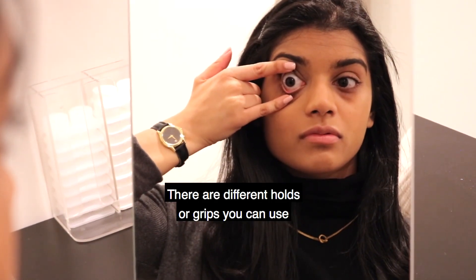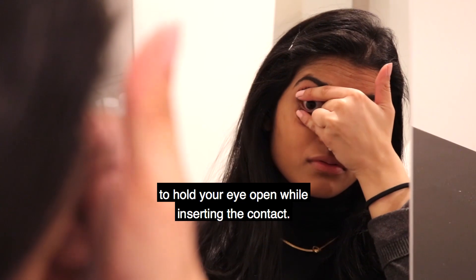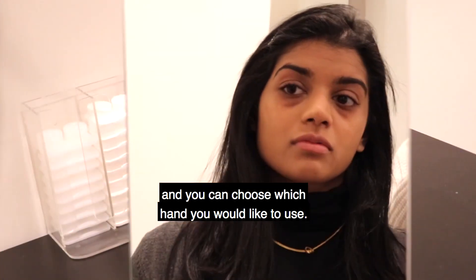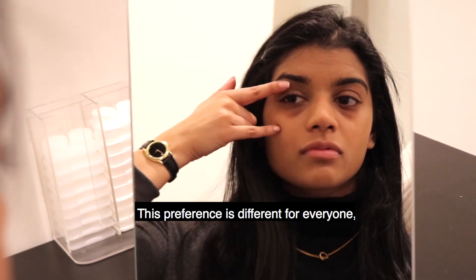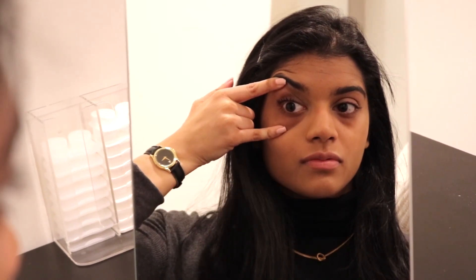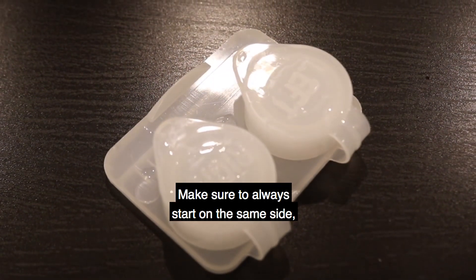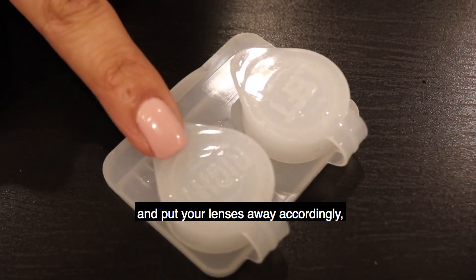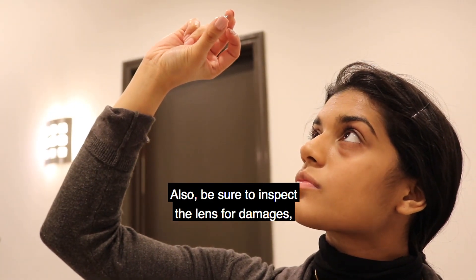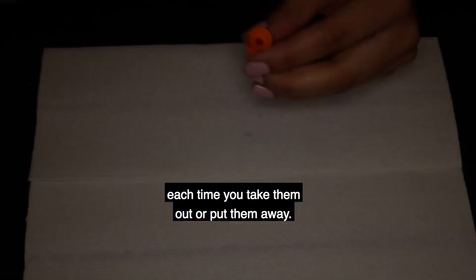There are different holds or grips you can use to hold your eye open while inserting the contact. It is important to always use the pinky and index finger, but you can choose which hand you would like to use. This preference is different for everyone, so just use the hand that is the most comfortable for you. Make sure to always start on the same side and put your lenses away accordingly, as they may have different prescriptions for each eye. Also, be sure to inspect the lens for damages, scratches, or chips each time you take them out or put them away.